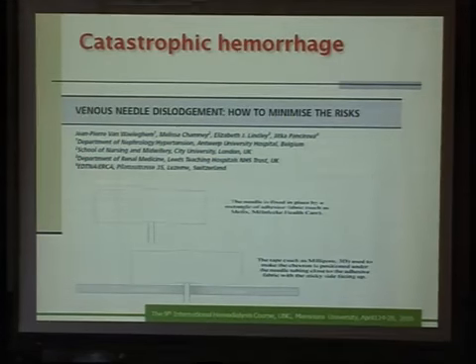I'm going to talk about a very important issue that could help in preventing this catastrophe, which is fixation of the dialysis needle. This is the proper way to fix the dialysis needle.